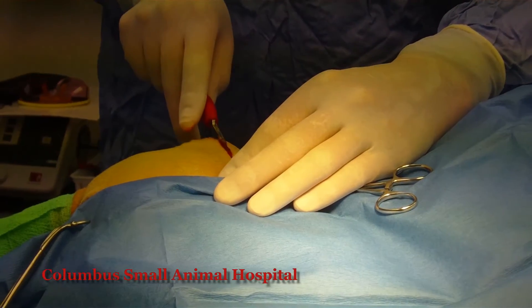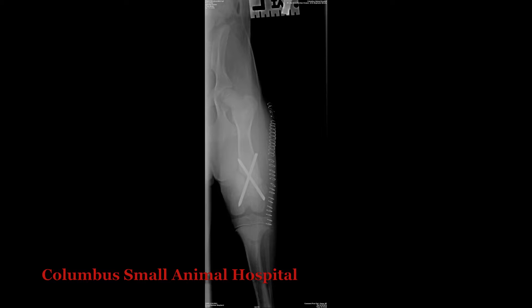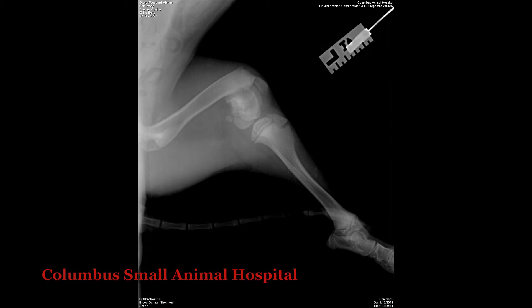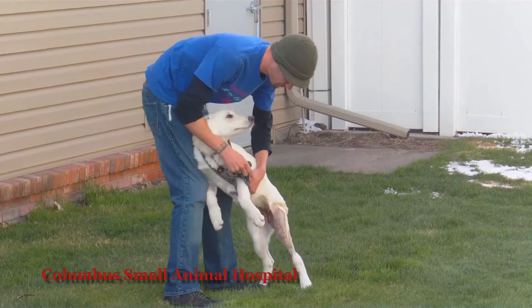We cut down over the fracture on the lateral side, get the fracture reduced and affixed, and here are our cross pins placed nicely. Here's the other view — you can see the difference with that distal femur now in its correct location compared to what it was like before. This is truly amazing and very gratifying.